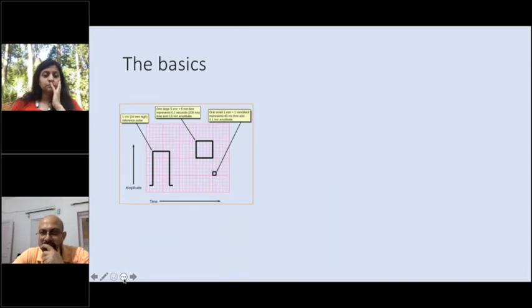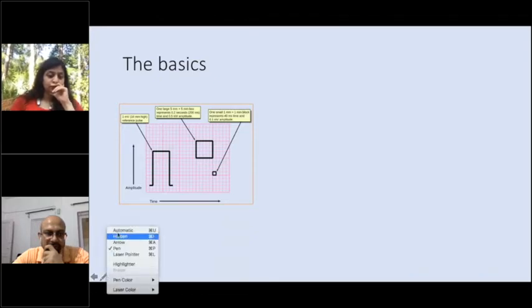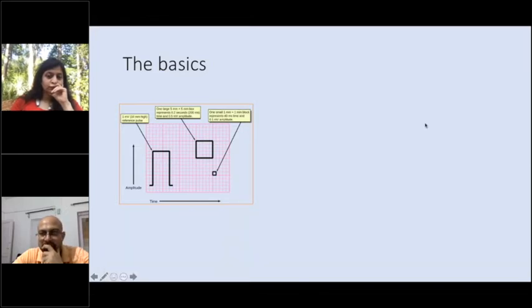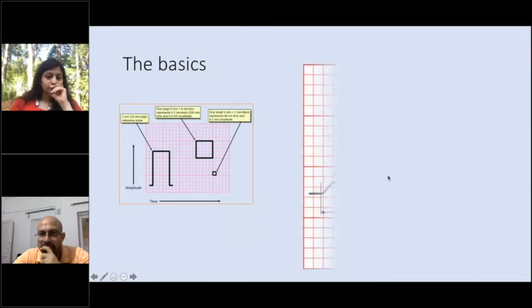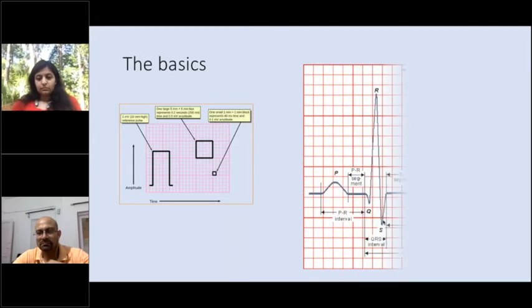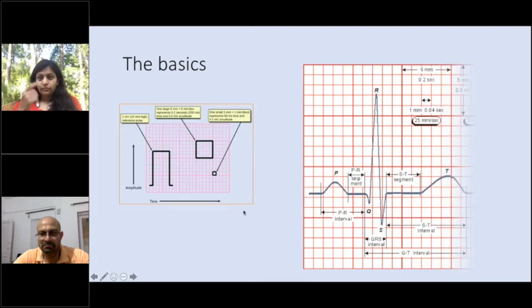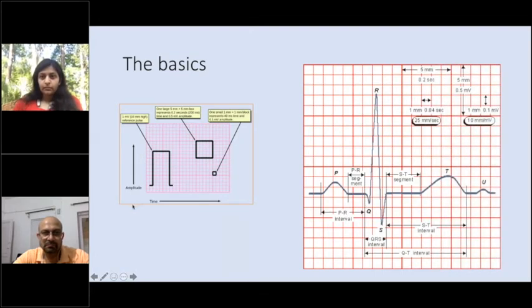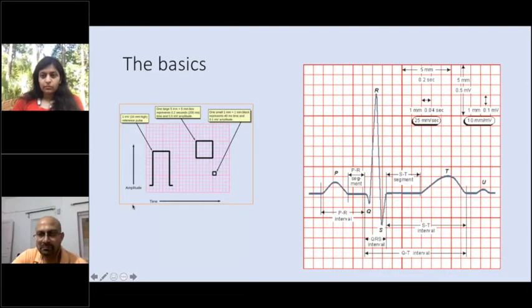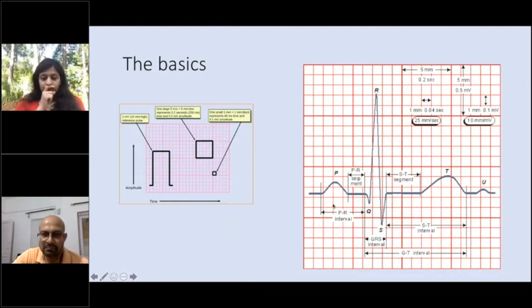You can see there are small squares and a big square composed of five small squares. Each small square horizontally translates to 0.04 second and vertically to 0.1 millivolt. Let's look at a basic electrocardiogram tracing and the different waves. We have a P wave which signifies atrial depolarization, then we have a PR segment.